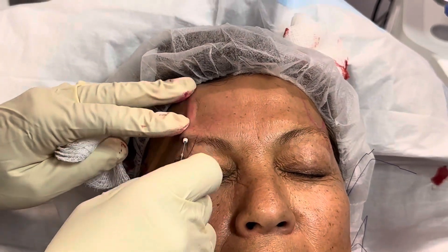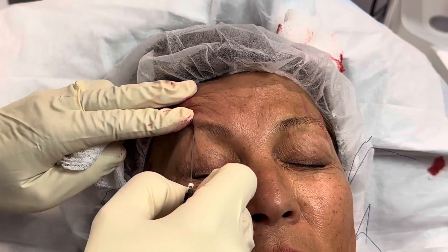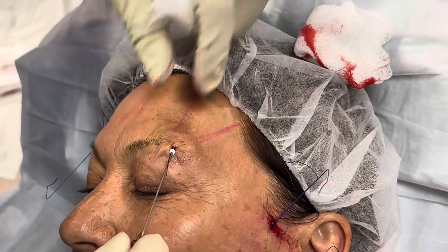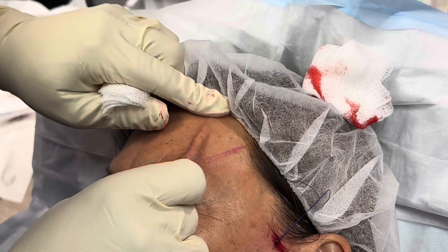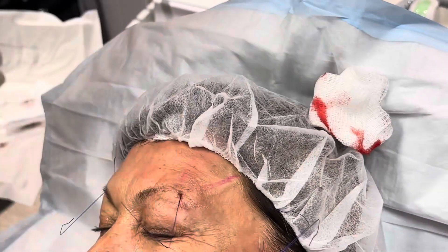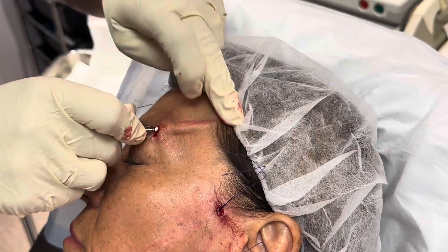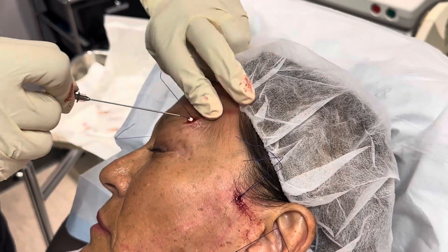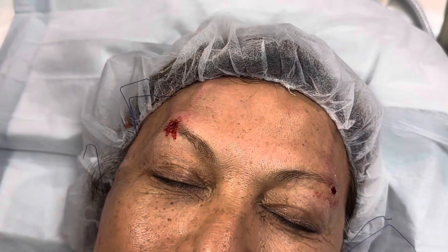Now we are doing the brow. Notice we're doing a reverse insertion — so instead of going from top to bottom, we're going in from the bottom. We insert the threads all the way up past the hairline, then we can pull on the thread to lift. Here we're going in two directions: we just went up, and now we're going up and back a little bit. We pull everything tight and snip.